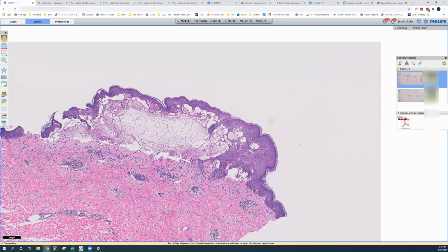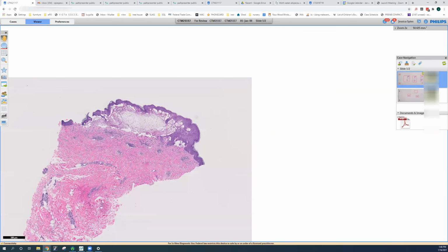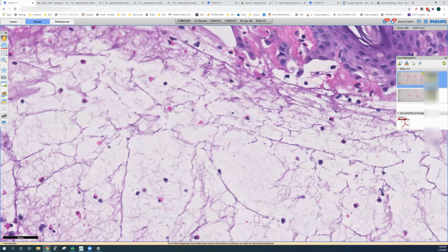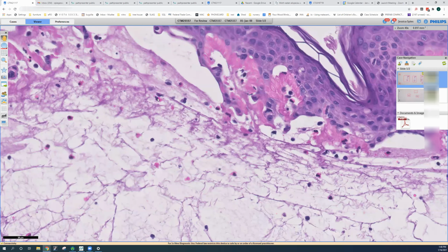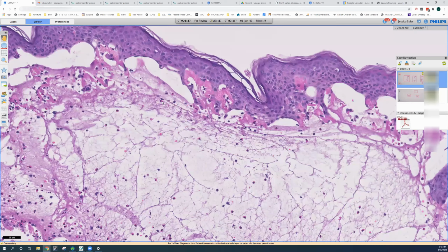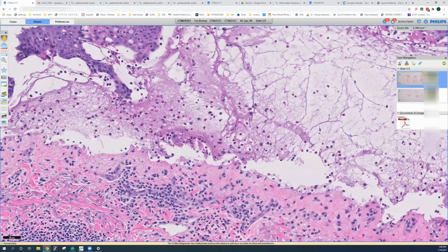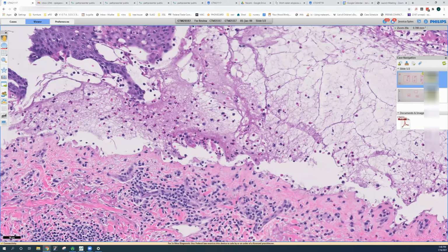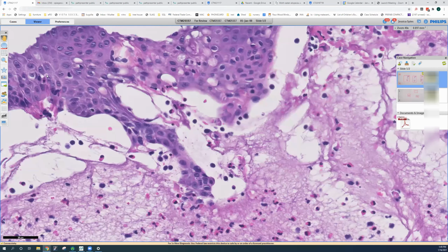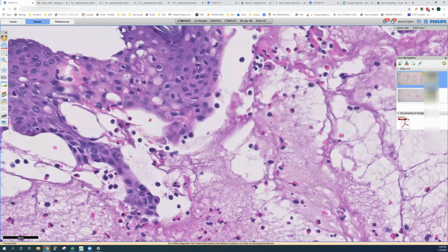this came in as rule-out bullous pemphigoid with a DIF biopsy, and you can see here at low power, we've got an intact epidermis, a subepidermal blister, and it's filled with eosinophils. Here the bilobed nucleus with the eosinophilic granules in the cytoplasm. So they're not the only inflammatory cell in here, but they are by far the predominant inflammatory cell in this subepidermal blister. And here there's some eosinophils even in the epidermis.